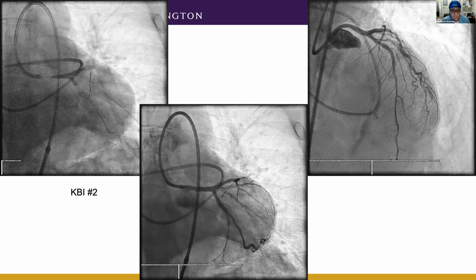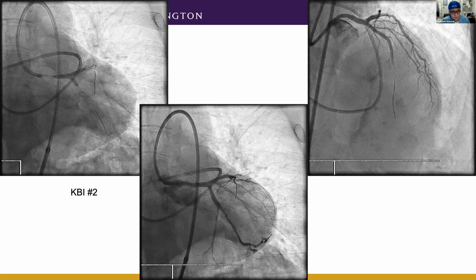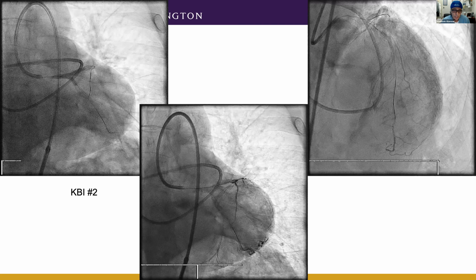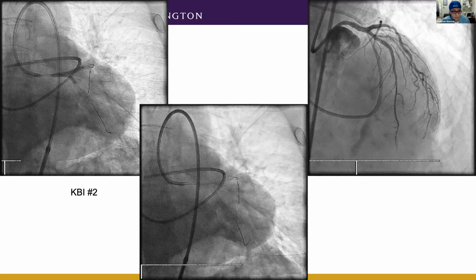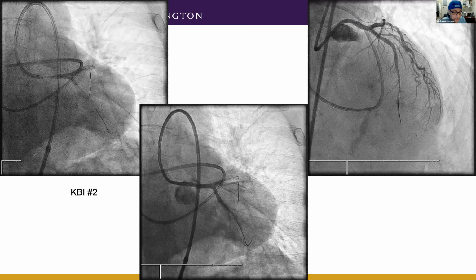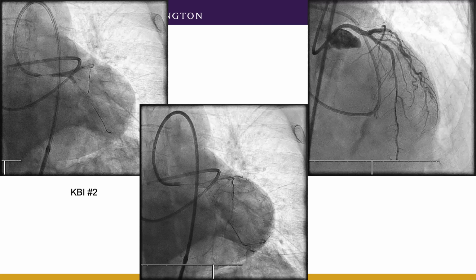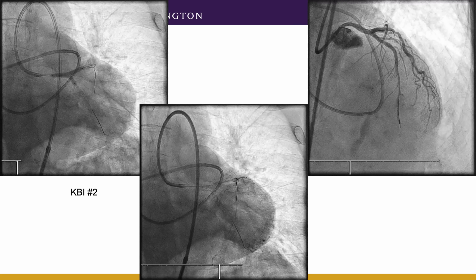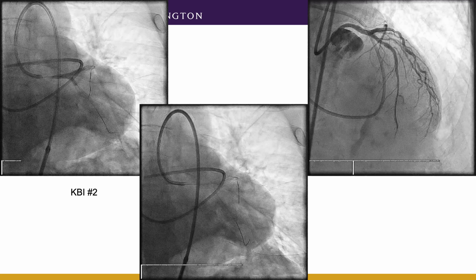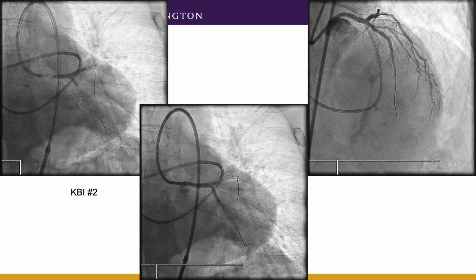But believe it or not, in the era of balloon angioplasty and bare metal stents, if you achieved really good results with balloon angioplasty, those tend to be durable too. Target vessel revascularization beyond the first 3 months became similar if it stays open. It's a big enough territory. I think you could certainly argue to do that differently, but it looked reasonable enough. We decided to let him earn a further intervention there, figuring he could come back with that. But I think you could argue either way.